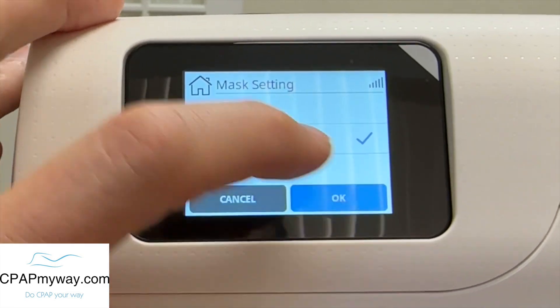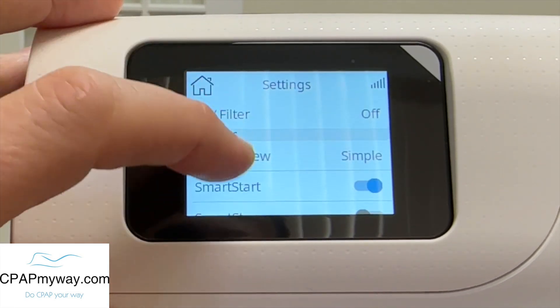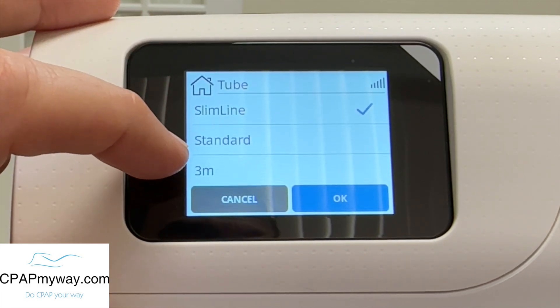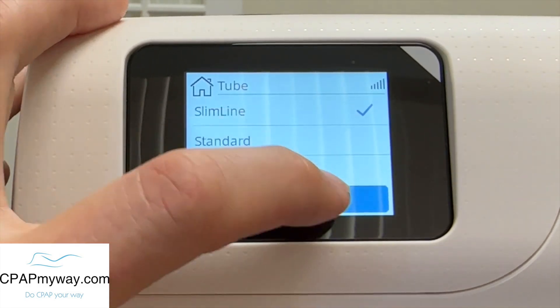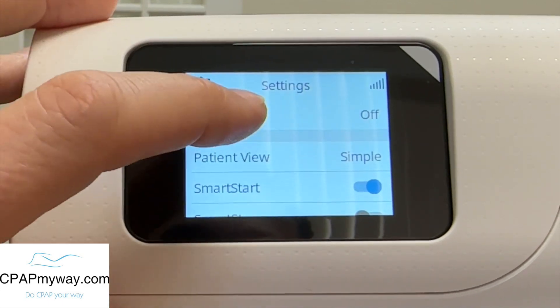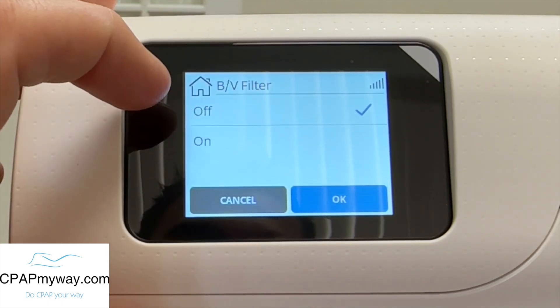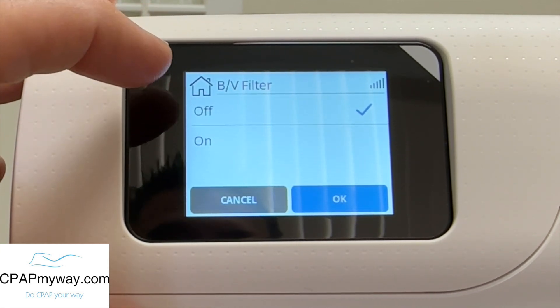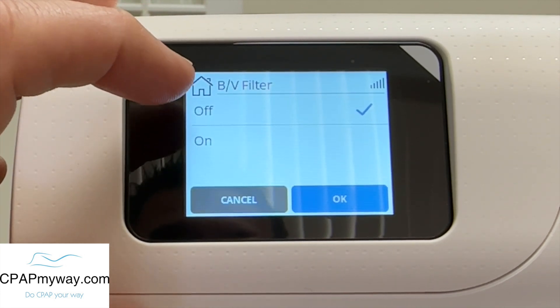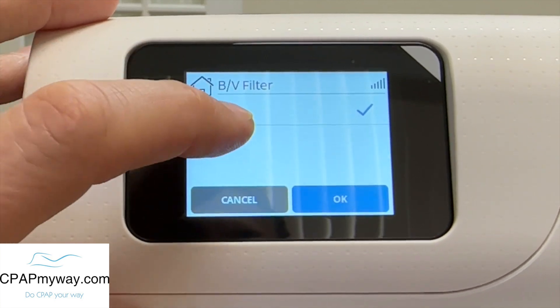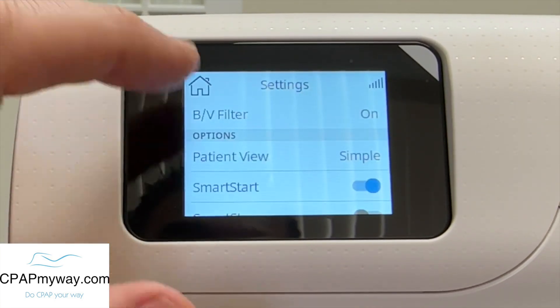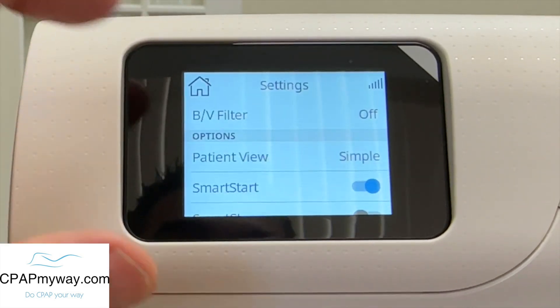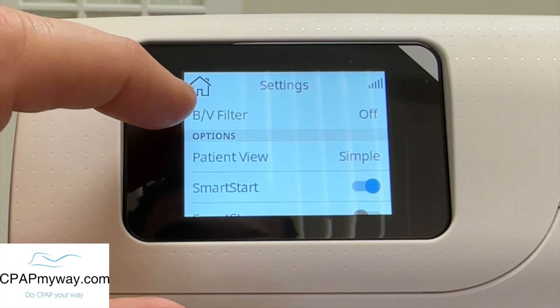Mask setting: pillows to nasal. Tube can be slimline, standard, or three meters — I don't know what that actually stands for, to be honest. Bacteria filter — this BV filter, bacteria or viral filter. If you use one of those little filters, I'll put an image up here so you can see it. You will want to tell the machine that you've put one of those filters in line so that it can account for it. 99% chance that you're not using a bacteria filter — you will know if you are.